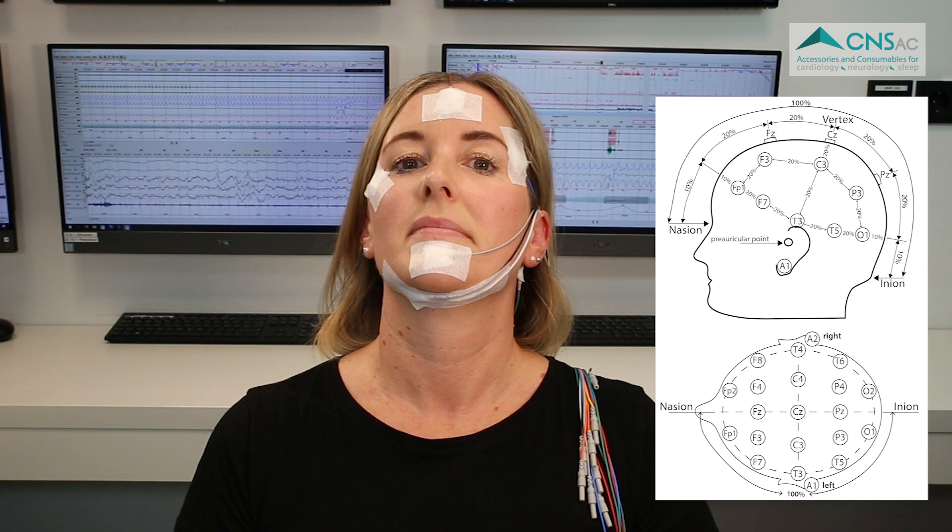Now the electrodes can be connected to your PSG or EEG device and you can start the measurement.